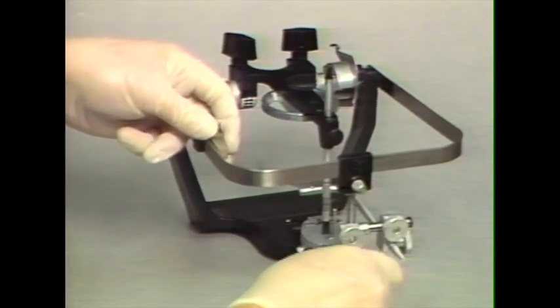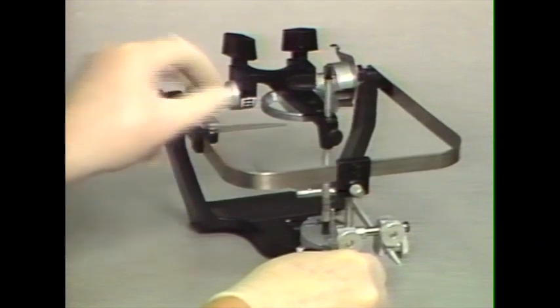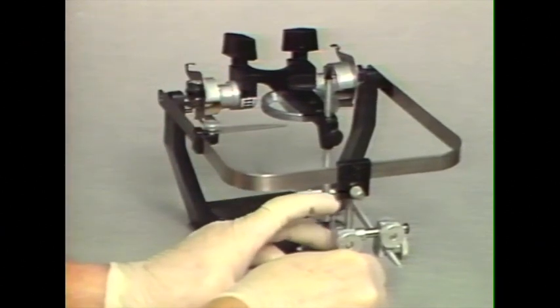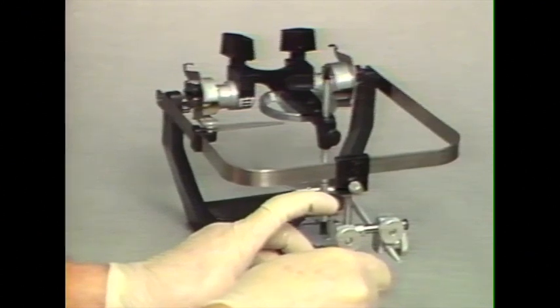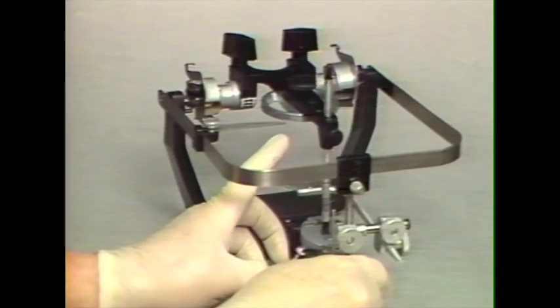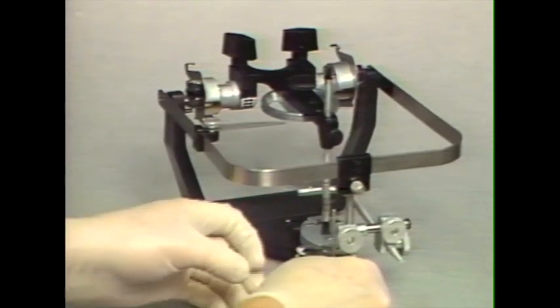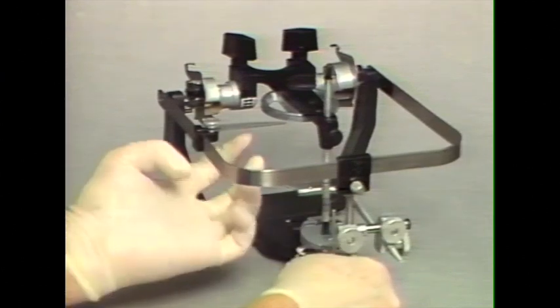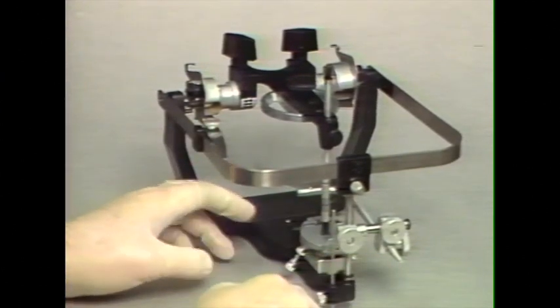We then can use this anterior elevating rod to set the proper vertical level of the Facebow record, and that is either to the axis orbital indicator if one is on the articulator here, or to the lower level of the maxillary mounting ring. We then would be ready to use plaster to attach the maxillary cast after we place cast support in the lower members so that the Facebow does not sag.